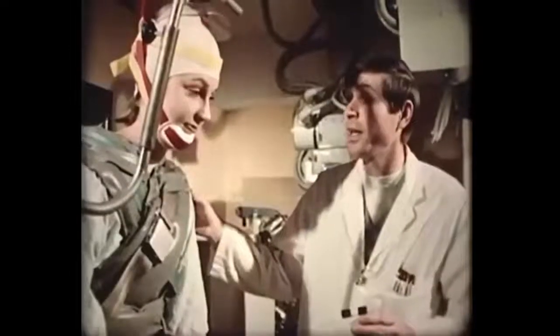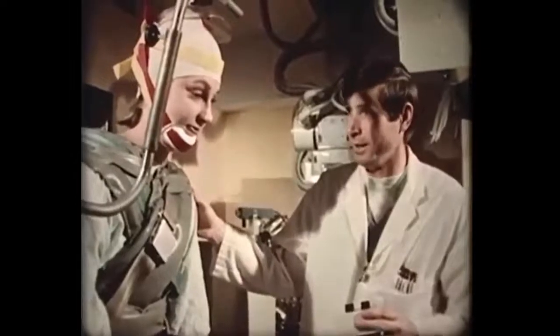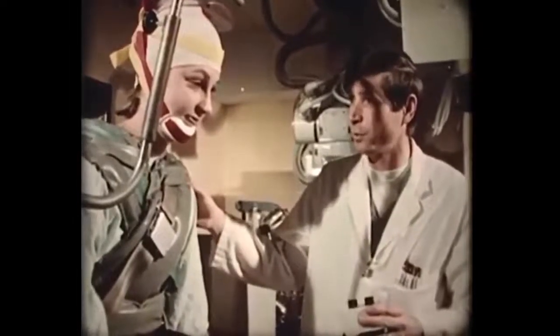Okay, it's going to be a little pain in your head. Okay, the air is going into your ventricle system, into your brain. Okay, there will be some pain.